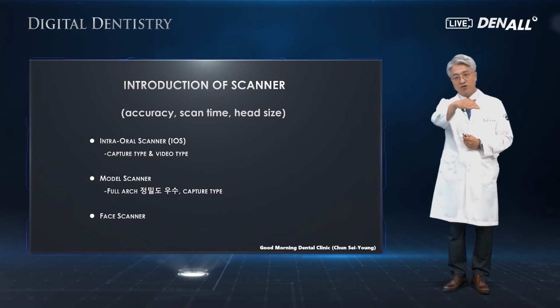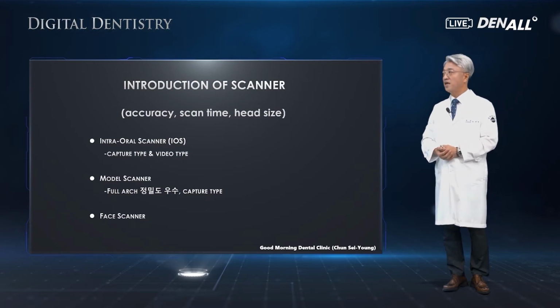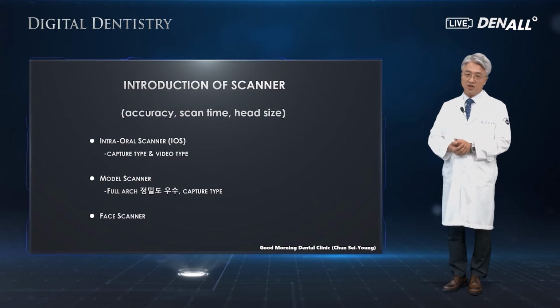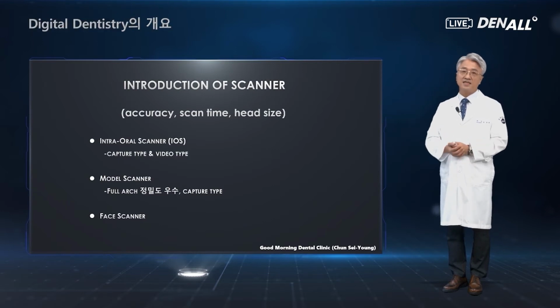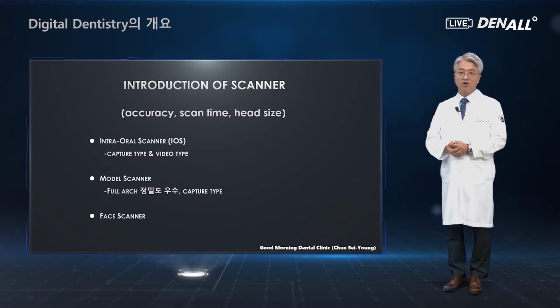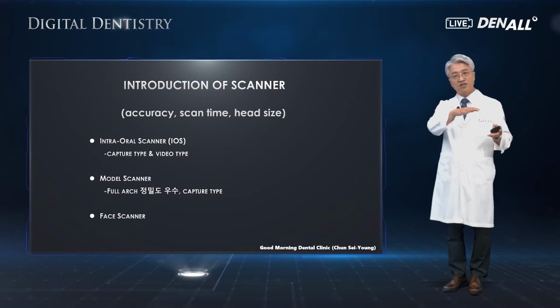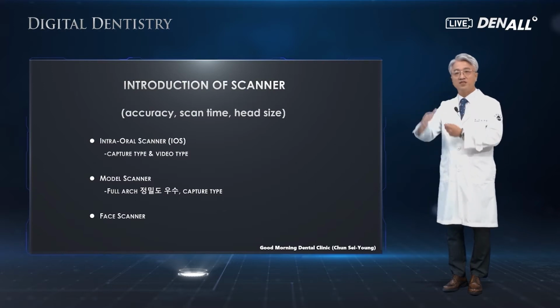Let's have a look at the types of intraoral scanners. This is most widely used for patients. The intraoral scanner has two types: capture type and video type. In the past, capture type scanners were widely used. Such scanners are switching to video type.